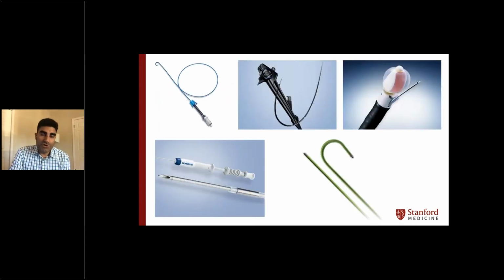As I was mentioning, at the top left, I was using the superDimension catheter quite frequently. I commonly use an MP190 bronchoscope, the ultra slim, but we use whatever scope is going to be best for the case. So if it's a TH190, it's a TH190. If it's a P190, it's a P190.